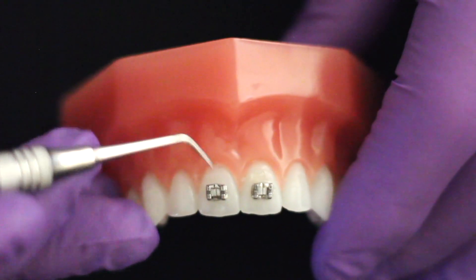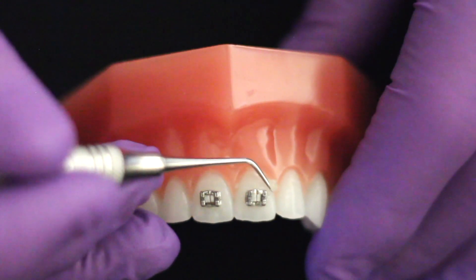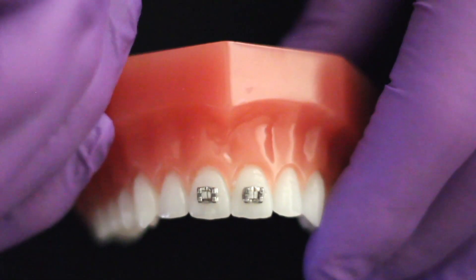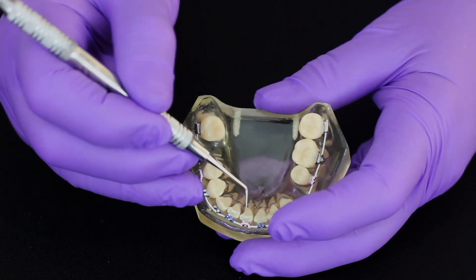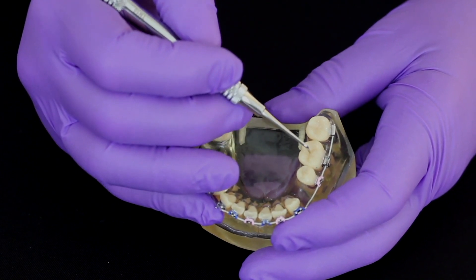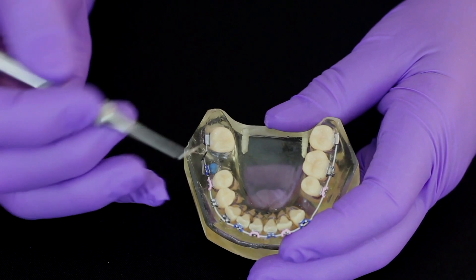Once the bracket has been positioned on the tooth, any excess adhesive around the bracket can be picked up with the tip of the probe and easily removed. The probe is also stiff enough to enable the operator to remove any debris from between the teeth. It can also be used as a regular dental probe for probing a variety of dental structures.